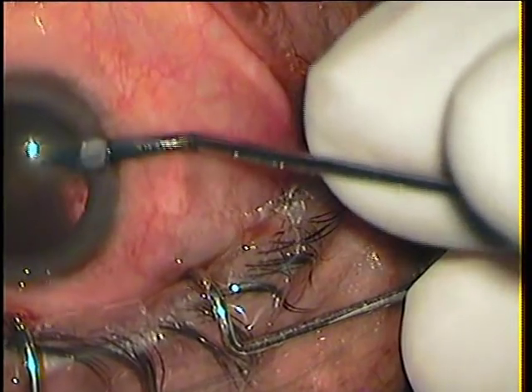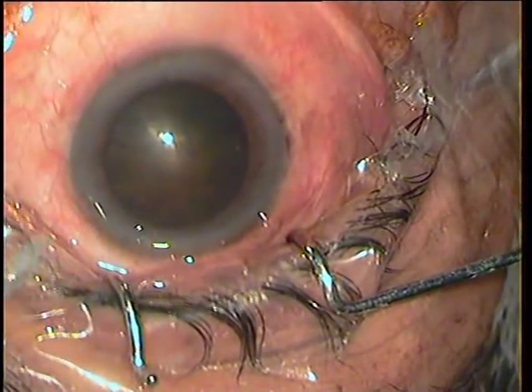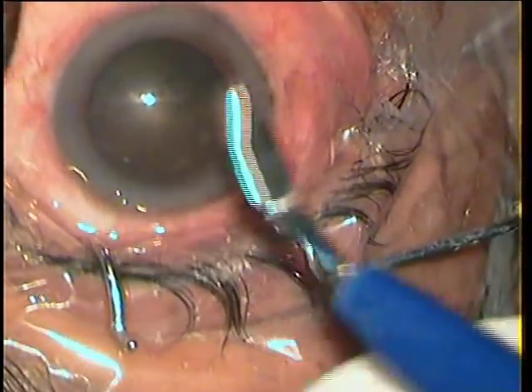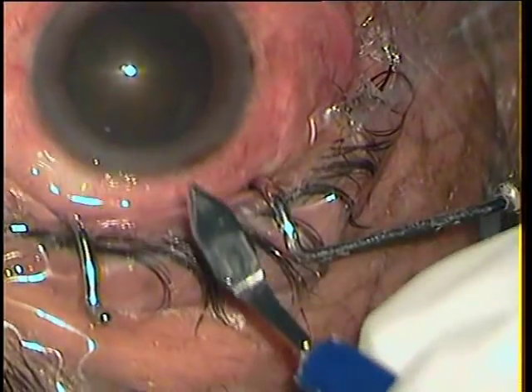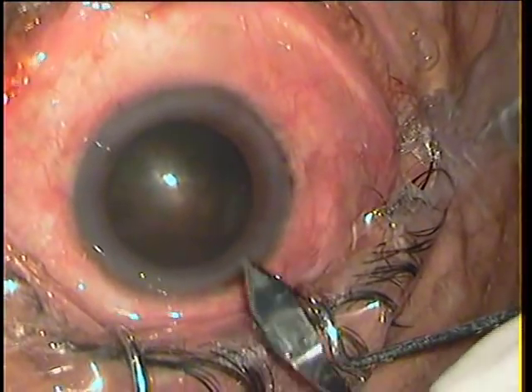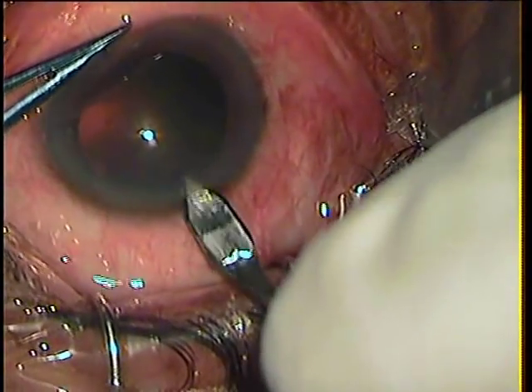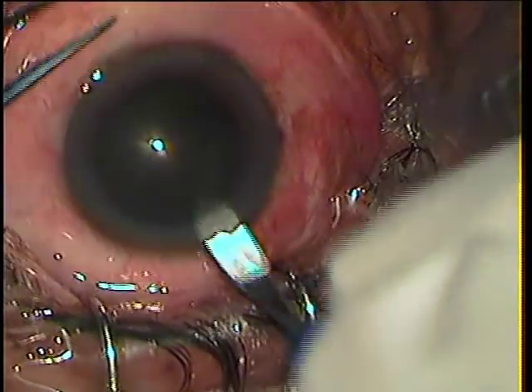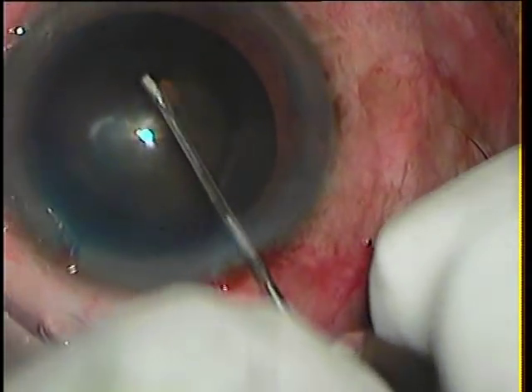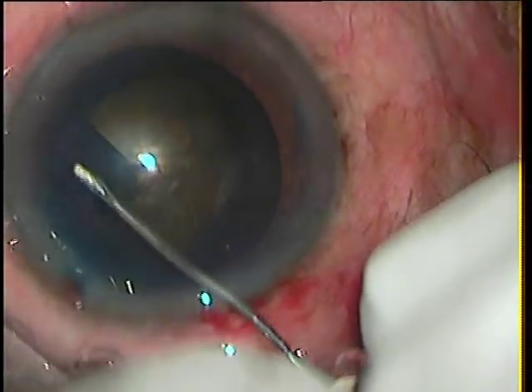This was a grade 3 cataract, a bit leathery, but I did not expect much problems. More so because I had done the other eye just a few months back without any complications. The case is being done under topical anesthesia, incisions made by a 2.6mm keratome.